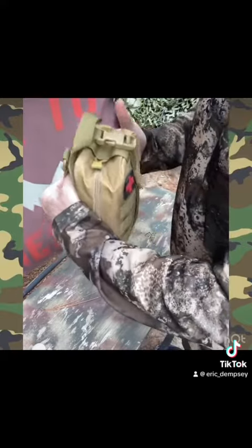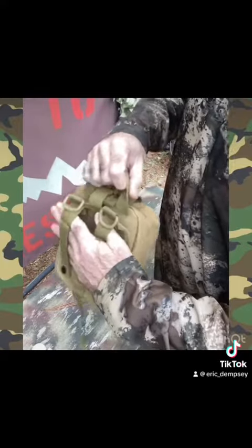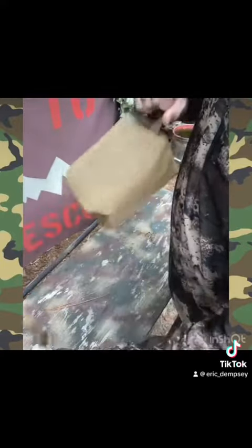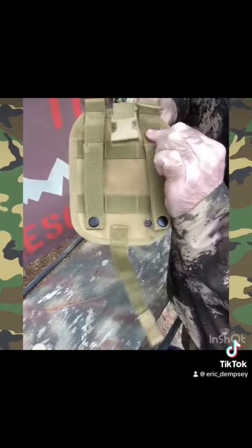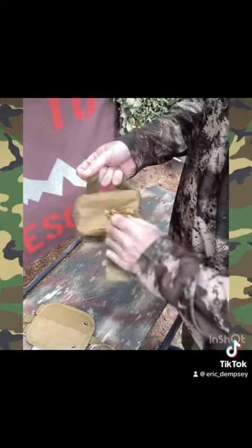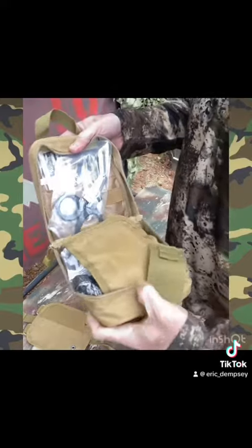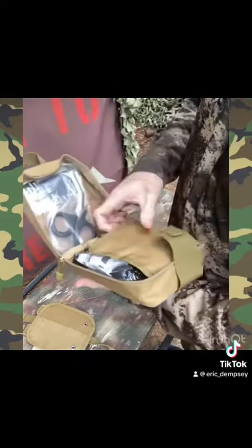So you can have it mounted to a solid object like your vehicle or whatnot, and to open it up you just bust the clip off, pull off the strap, then grab the handle and pull it right off the tearaway back flap. Then velcro top, two zippers — rapid deployment, boom, opens right up.